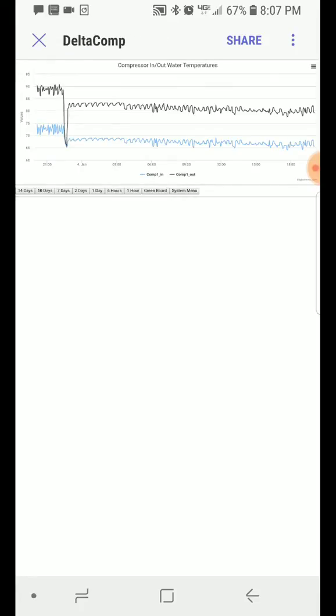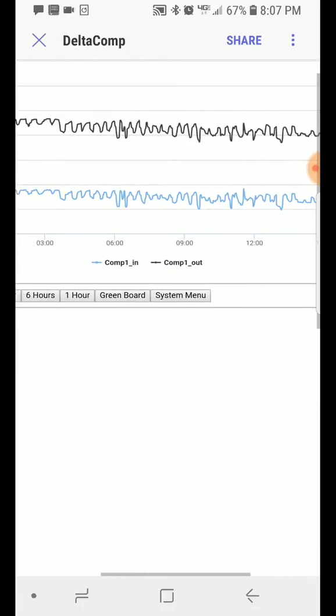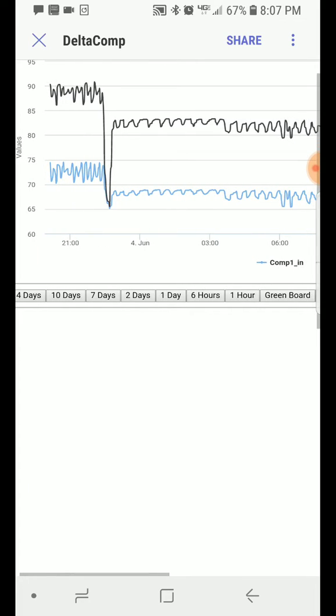It takes you to a graph of the incoming and outgoing water temperatures going in and out of a cold head compressor. So the blue line represents the incoming water temperature, the black line represents the outgoing water temperature. These should be at about 15 degree difference if everything's running normally. If the cold head compressor stops working, then they come together, just like that.